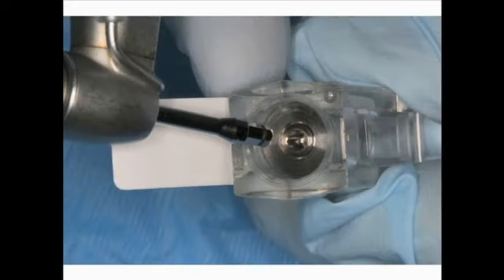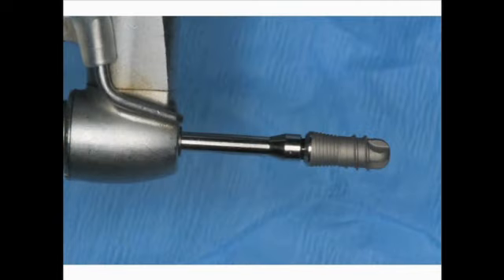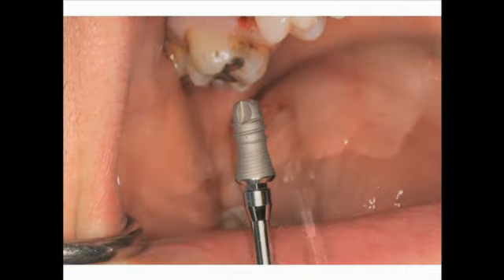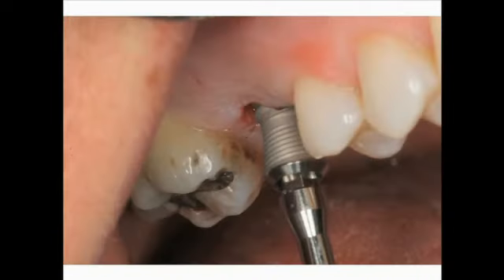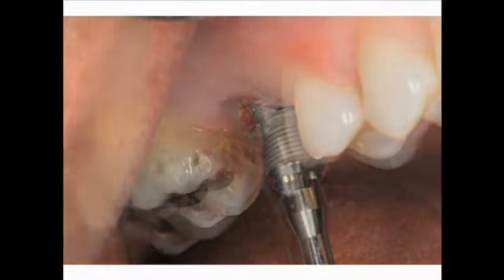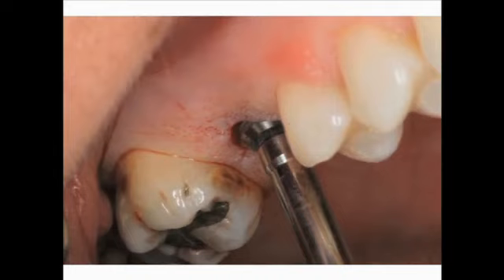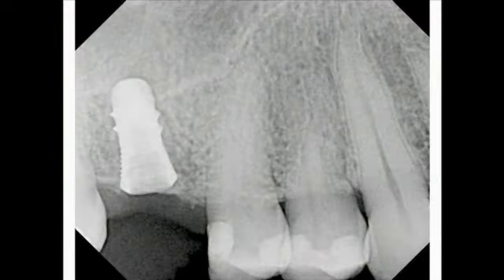An Octa implant driver is placed into the handpiece and then into the internal design of the implant. The implant is retained quite readily in the implant driver. The motor is turned down to record 25 Newton centimeters of torque. The implant is then driven into the osteotomy site and stops when 25 Newton centimeters of torque is achieved. A radiograph of the implant in position.